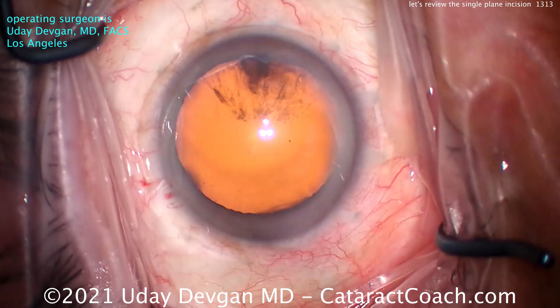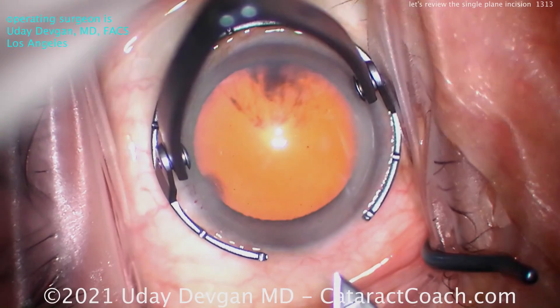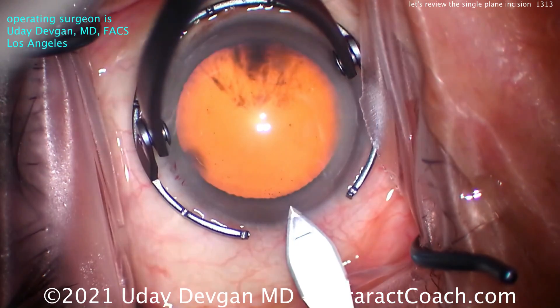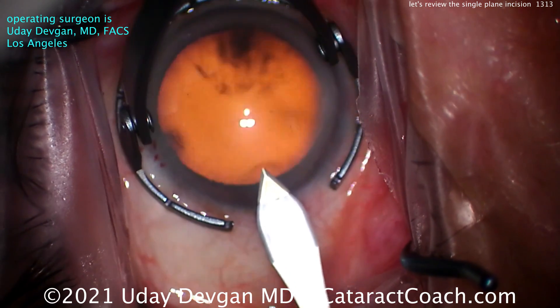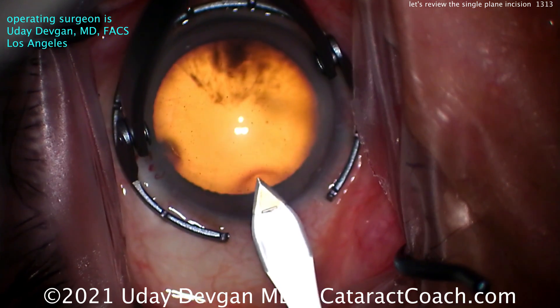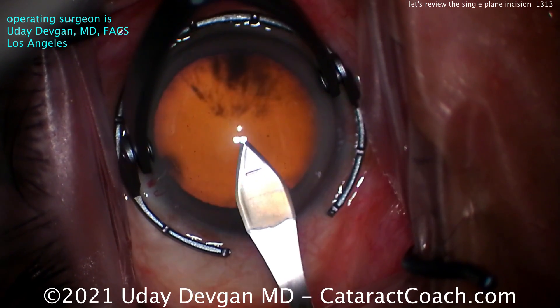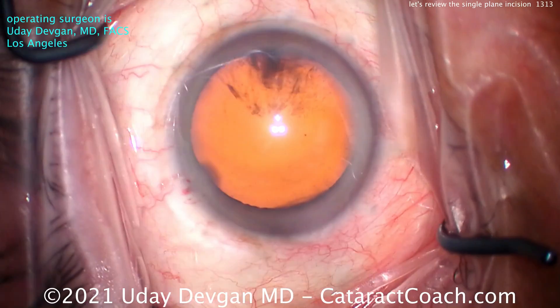Now you get the secret. Let's watch again in real time. Starting there at the limbal vessels, starting to advance it — look at the slight distortion of the cornea right there. We know we're in the right place. Push the blade towards the floor of the room, enter the eye. In and out. Done.